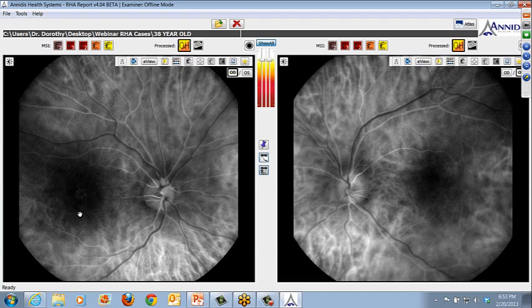I'm going to show you some other examples where there is fluid and show you how you can use other clinical clues to help guide you in your clinical diagnosis. This is also a nice example here because I've had a lot of questions reading the POI about arterial flow and also venous flow, depending on what moment the image is captured, as deoxygenated blood flows through the veins, and of course oxygenated blood through the arteries.